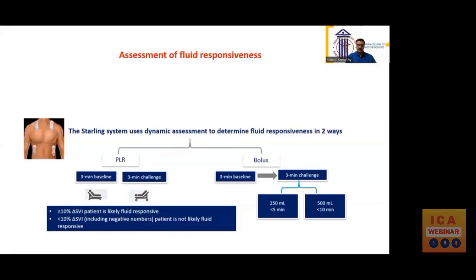The other method is by infusing a fluid bolus of about 250 ml in less than 5 minutes, or 500 ml in less than 10 minutes, and checking for an increase in the stroke volume. In both these techniques, an increase in the stroke volume by 10% indicates fluid responsiveness.